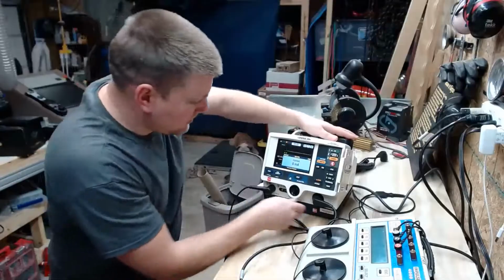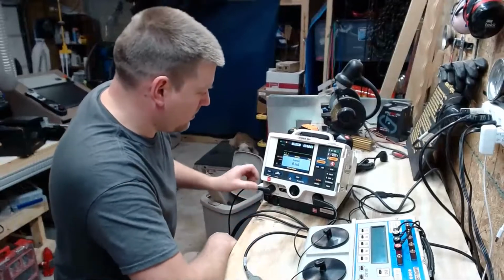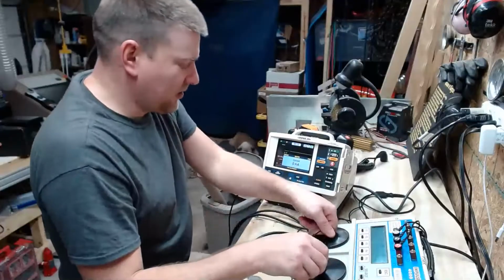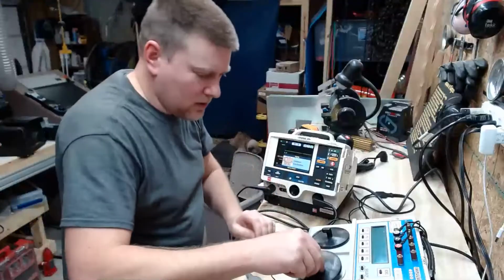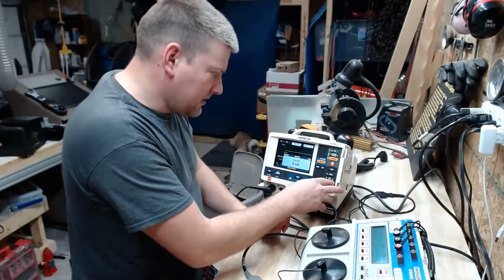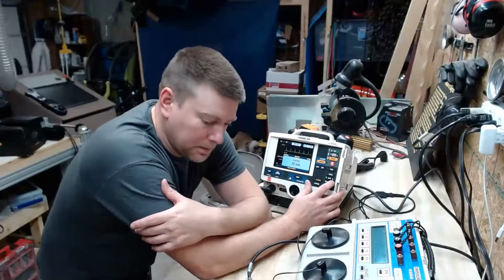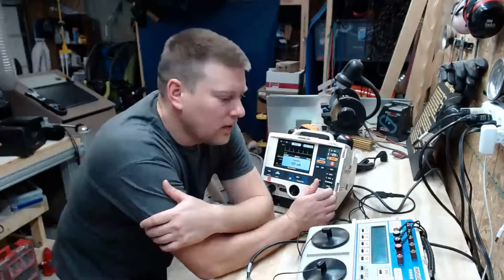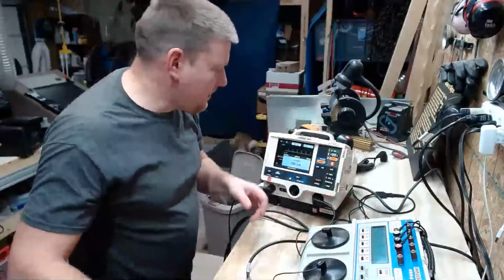Whoa, she's temperamental, folks. She is temperamental. So this guy. Woo. I'll tell you what, I didn't check this analyzer before I brought it home. Oh, that's interesting. As soon as it senses a fault, it will instantly stop the discharge. I didn't know that. Good to know. Let's take it back to 100 and 100. Okay, I have 100 ppm. I have 102.8, so again, 2.8% off.